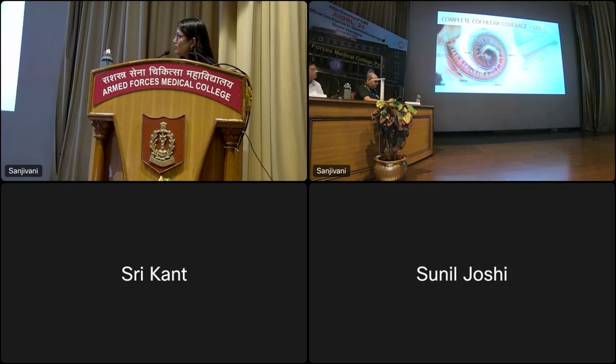Because if you were to have your first electrode, say over here, you insert it only from here to here, and the first electrode contact is sitting here. So that electrode contact, wherever it is sitting in the cochlea, the first contact will always take care of the lowest frequency provided. So say, for example, it is covering 200 hertz, and the 200 hertz is actually being presented at the 1000 hertz region. This is something called as place pitch mismatch. And this gives rise to a condition of distorted understanding of speech, and music perception becomes dissonant because the quality of sound is not going to be natural.